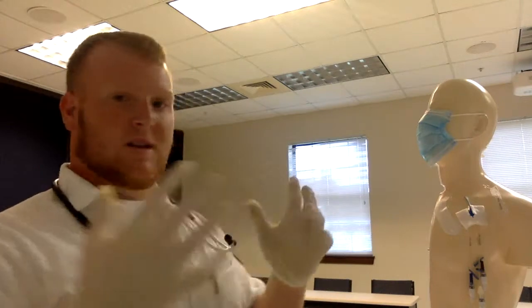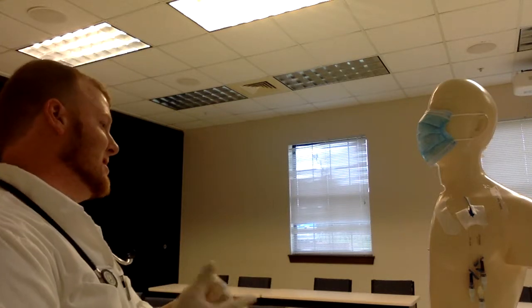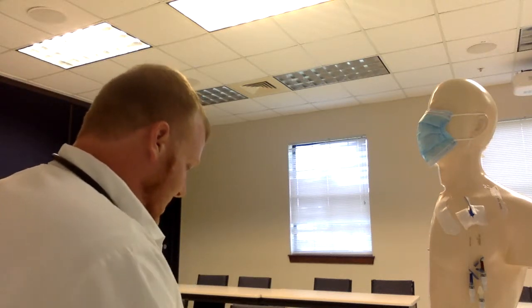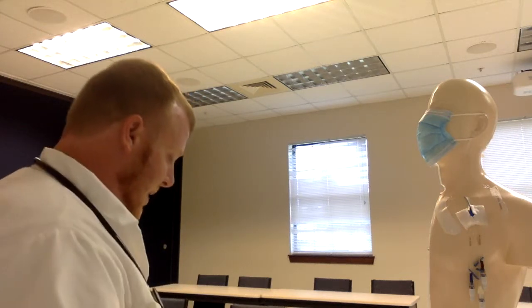This is still clean gloves. Your sterile field is here. Some packages, depending on the manufacturer, have a sterile field where you would open it up, making sure I'm touching the outside edges at all times, and never going back and forth and cross-contaminating your sterile field. Maintain it above waist height. You don't want to ever turn your back on your sterile field. All this movement I'm doing here is just to focus my attention on the video, but in the clinical setting, never turn my back on the sterile field. This package doesn't have a sterile field, but I'm going to treat it as if it does.